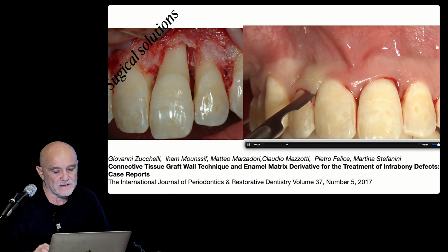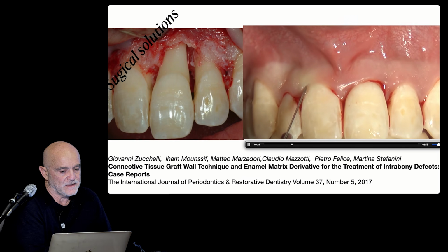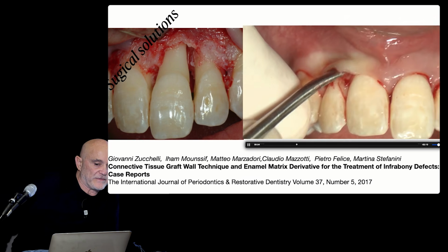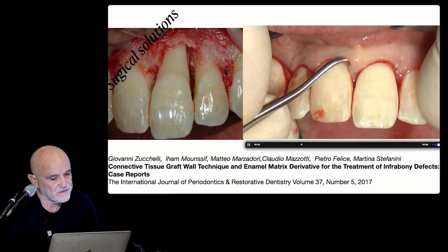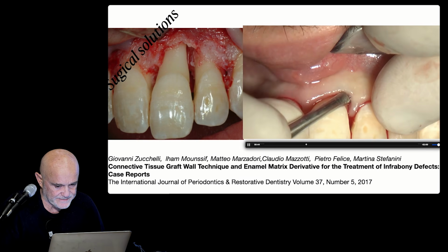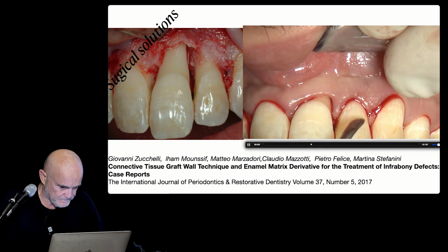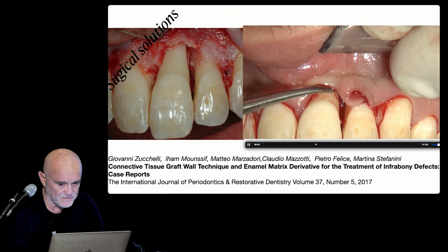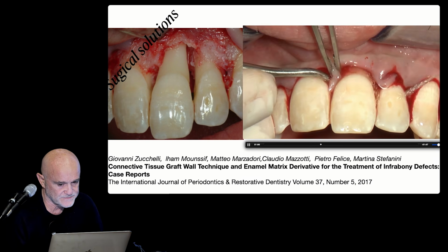We can associate this with a coronally advanced flap like we have already seen in the first module, because in the advancement of the flap here, it's important to advance also the papilla that is left connected to the buccal flap, and it is separated from the palatal flap with the palatal incision. The entire supracrestal soft tissue is elevated full thickness because it's intact. If there is none, the tooth has to be extracted.